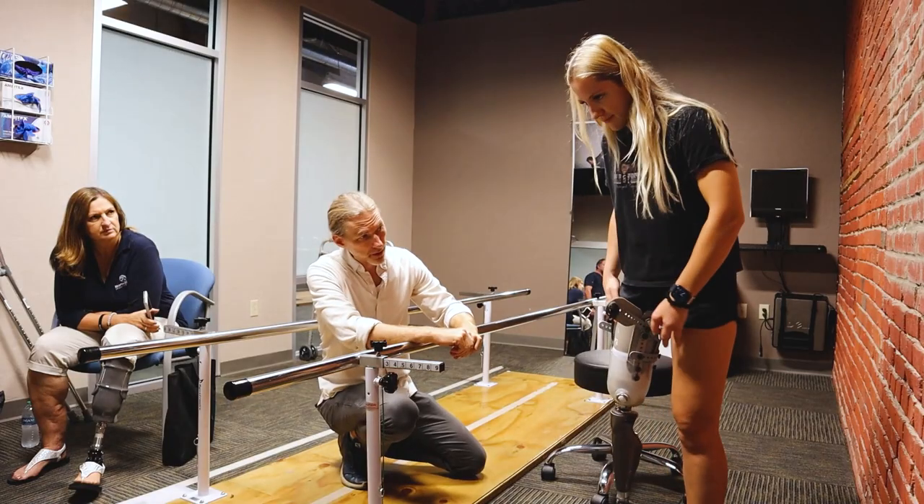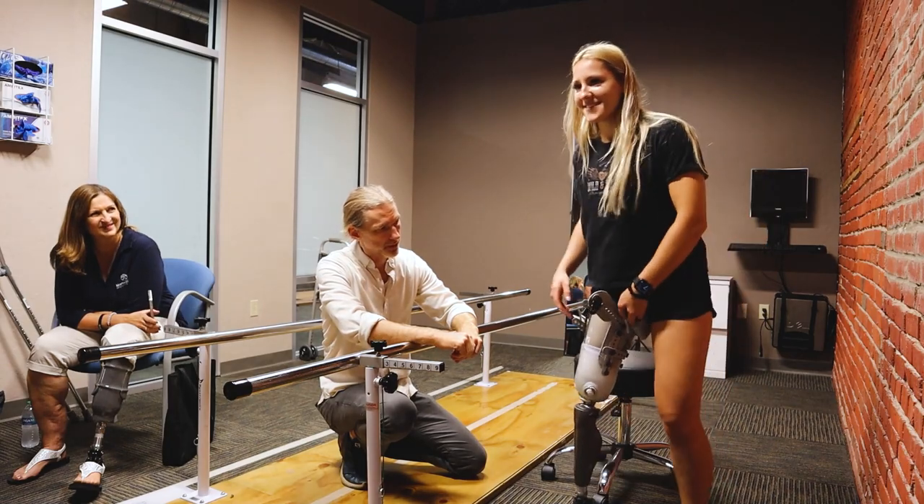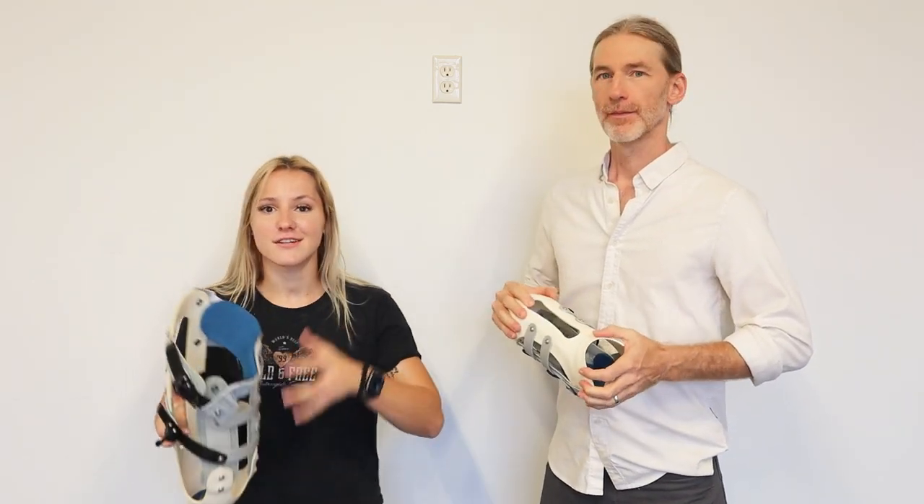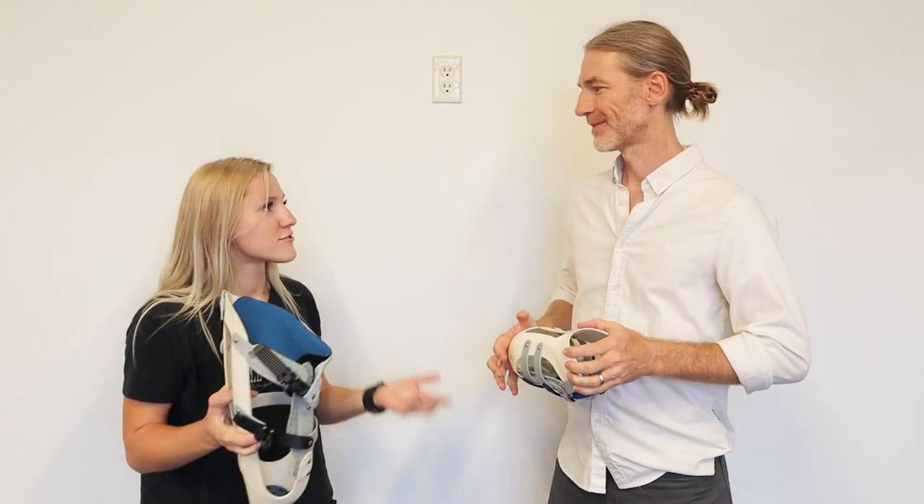I got to meet Jay Martin and he has been so incredible. I am here with Jay Martin, the founder of Martin Bionics, and we are going to talk more about the socket design and the history of Martin Bionics. Jay, why don't you go ahead and introduce yourself and tell us your history and background.